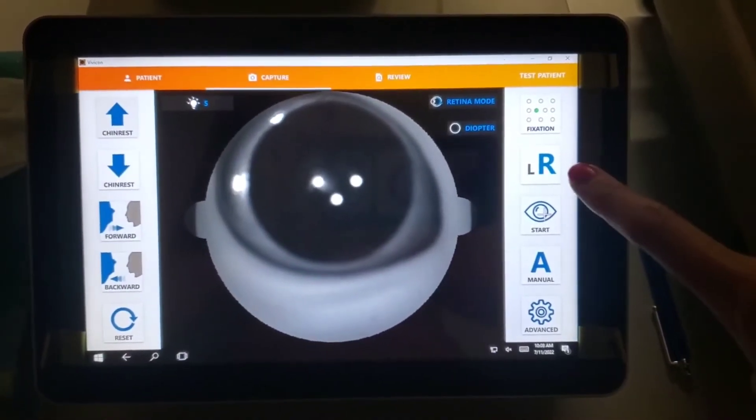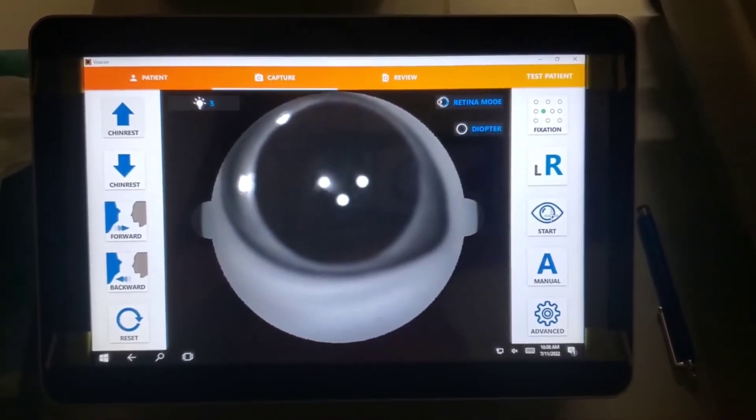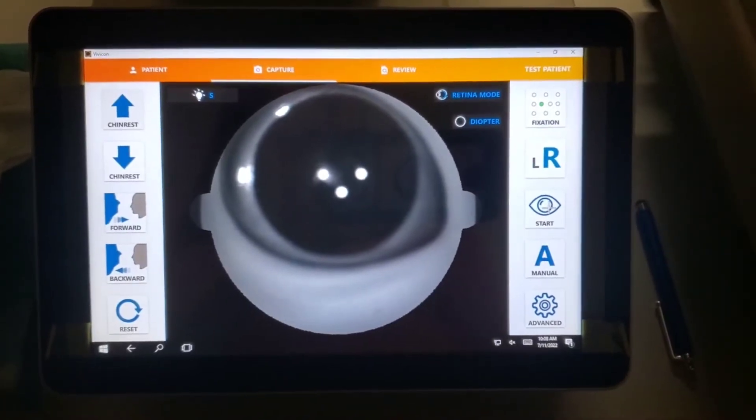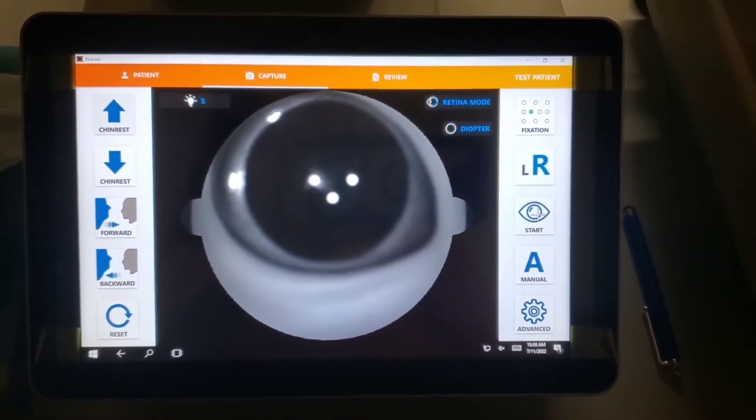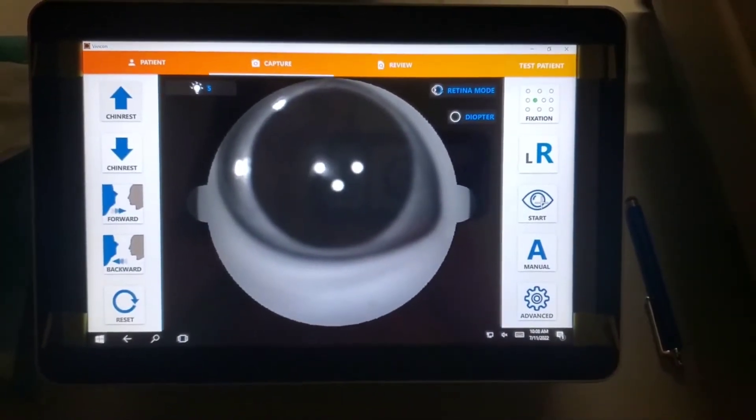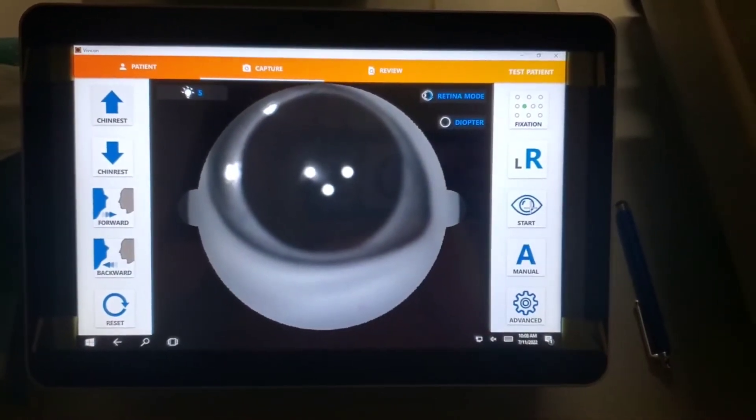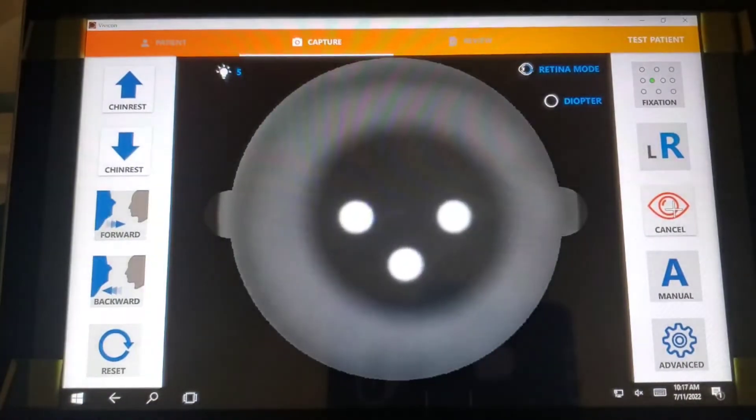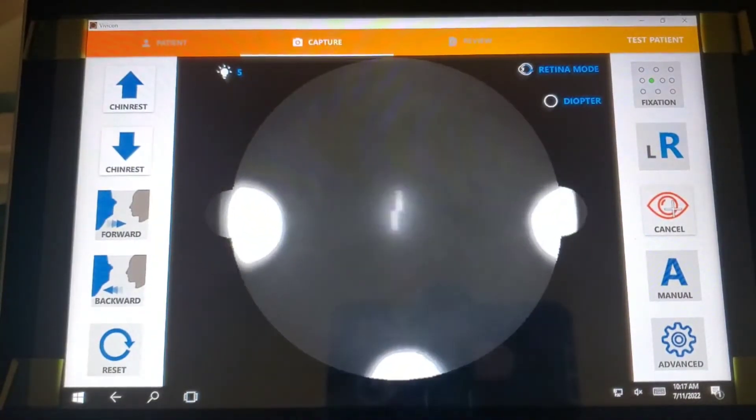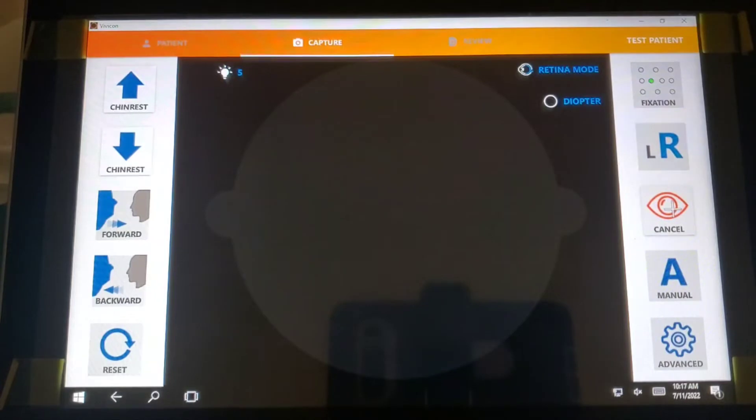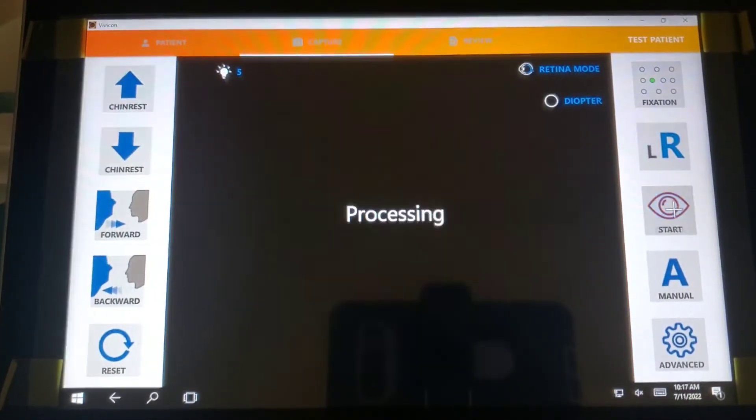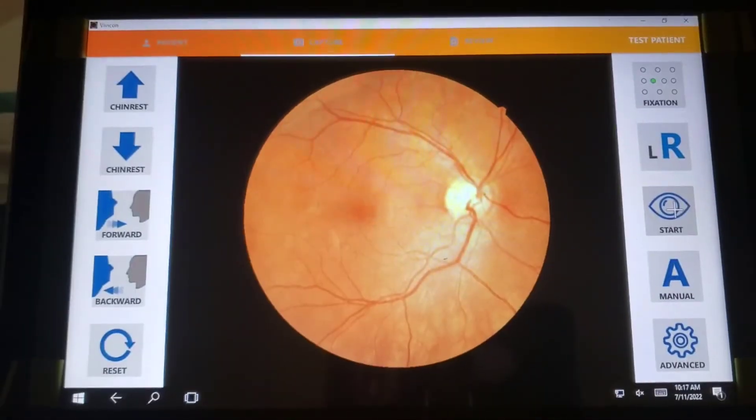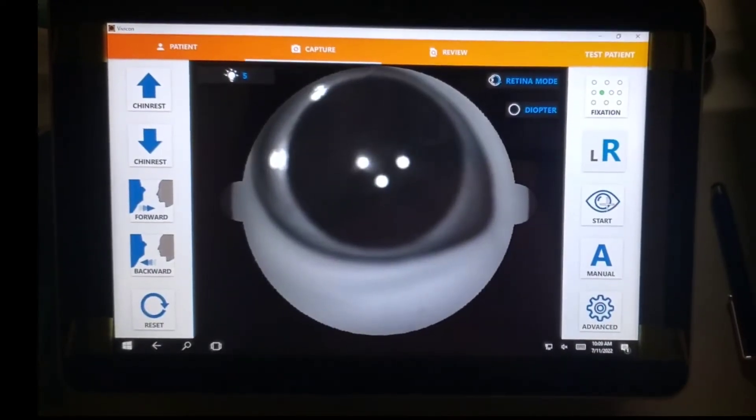We're going to do the right eye first. The machine is shifted over to the right eye and the right R here is highlighted blue. So when the patient is ready, we're just going to hit start. This is an automatic machine. It will automatically take the photo and focus for us. I'm going to let it run through an automatic scan.